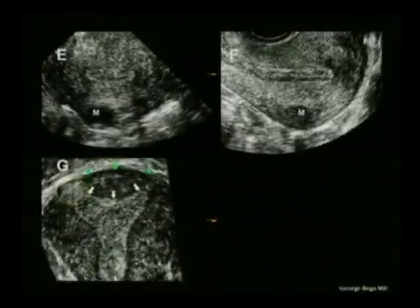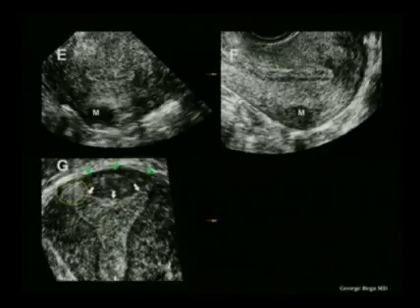trimester. Artifacts are a big deal in 3D ultrasound. They are of different sources. They are multiple. It's probably one of the weakest points in 3D ultrasound. Artifacts are really a problem. There are a number of them related to acquisition, display, rendering, and post-processing and editing. Probably the most common ones have to do with the fact that we have motion artifacts in slow acquisitions.